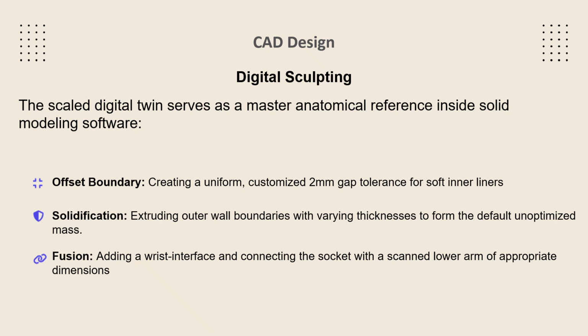The clearance is 2 mm. This is critical. It provides the precise physical space to insert an elastomeric inner liner cushioning the skin and preventing localized friction. Next is the solidification.